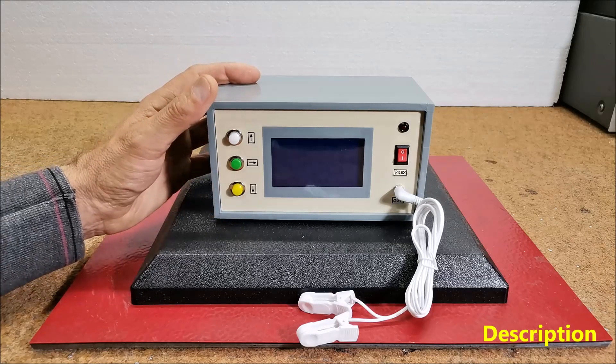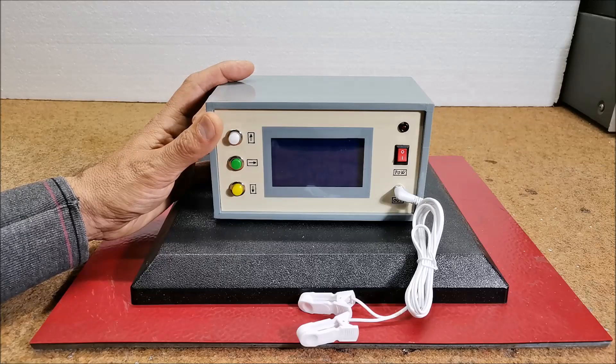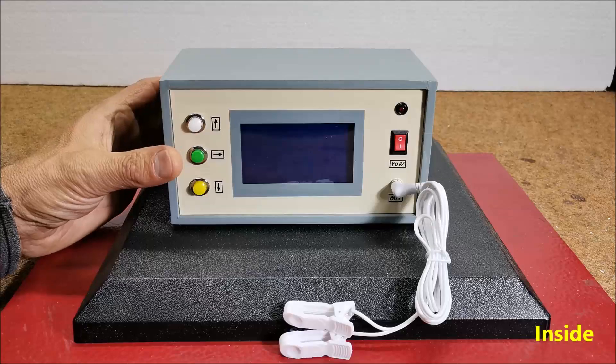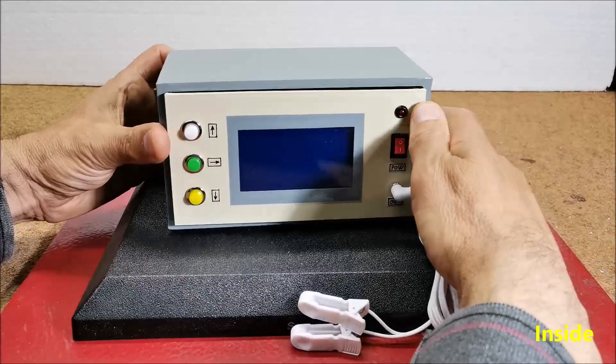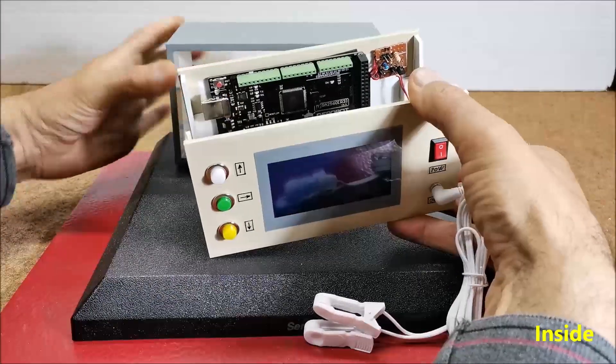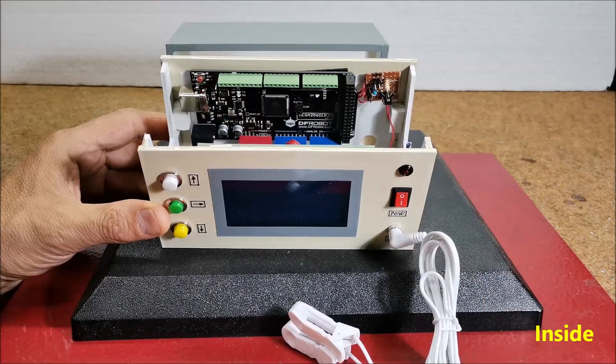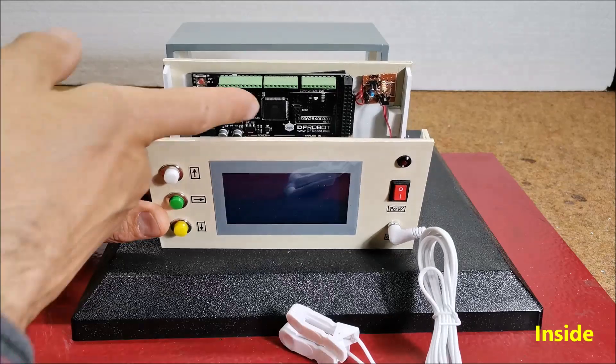This is how I want to capture the real value of such devices that are sold today on the internet. The device is very simple to build and contains only a few components. The first is an Arduino Mega microcontroller — in my case, a DF Robot Arduino Mega.